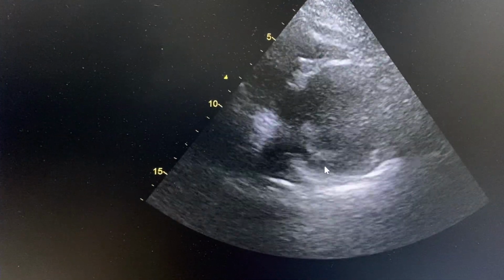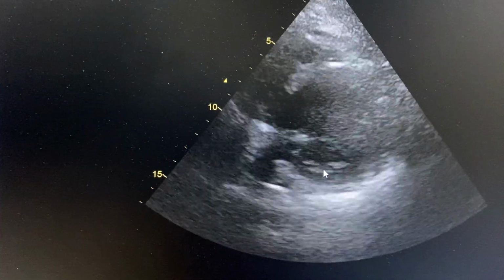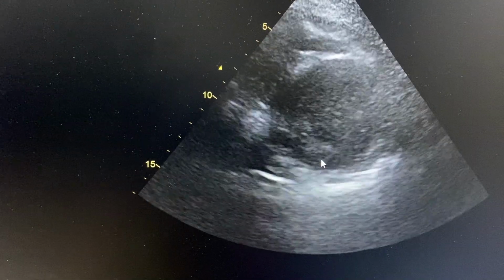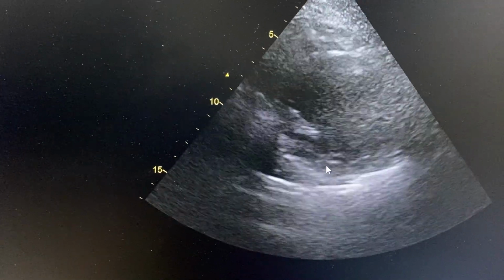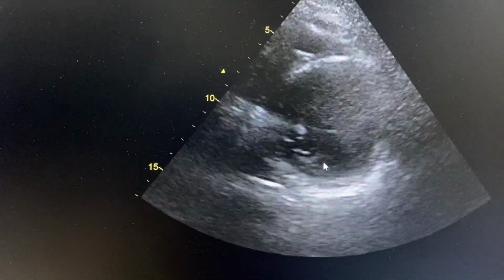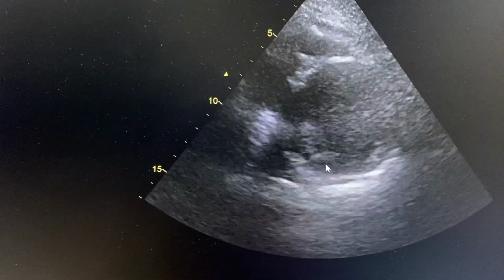This is a patient who had PCI in 2019. So that's how we can summarize. I'm just showing you the wall motion abnormalities. We are going to see more views. The windows were not clear on this patient, but this is an example of wall motion abnormality.